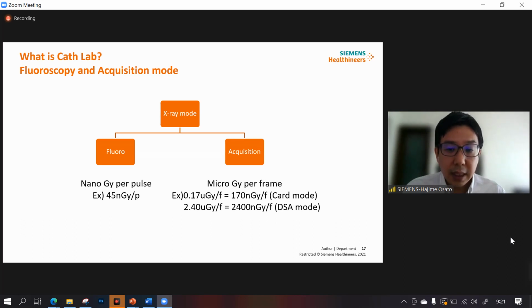The amount is more, and it provides better image quality, so better signal noise ratio and contrast than fluoro. So if you want to reduce radiation dose as well, please consider the trend in each procedure.